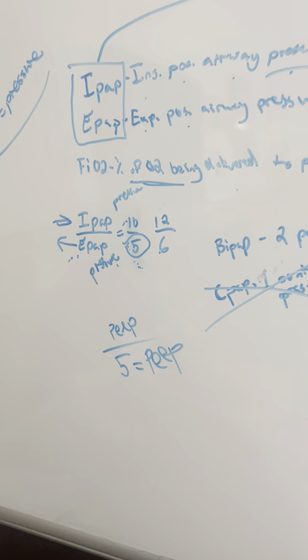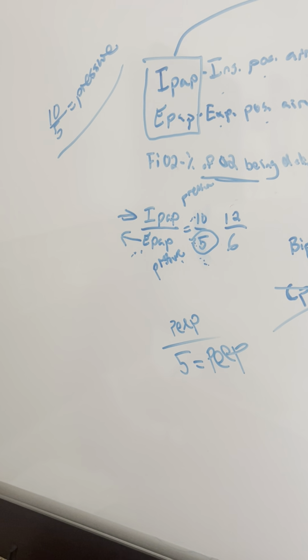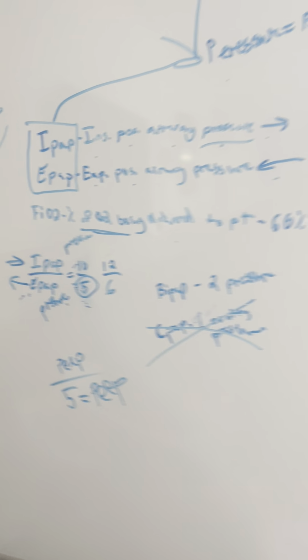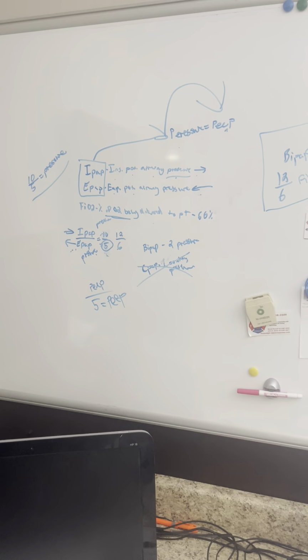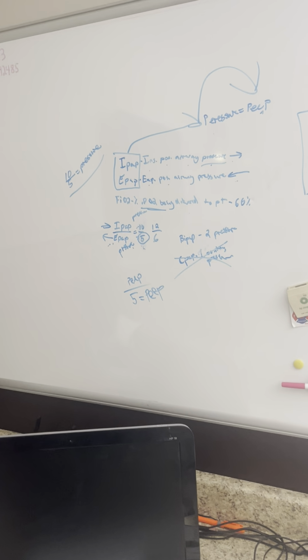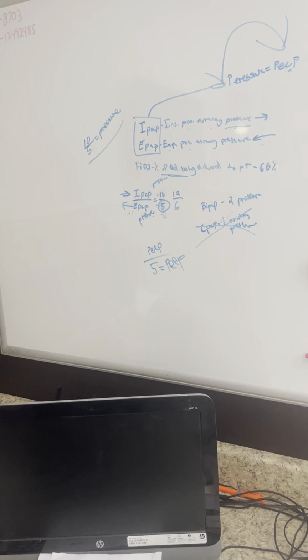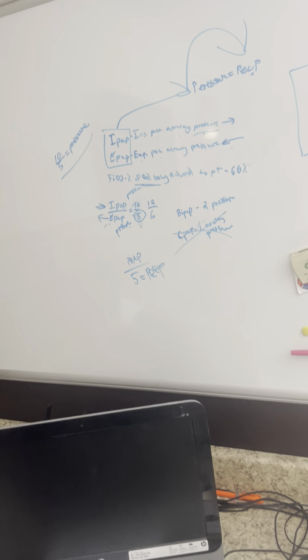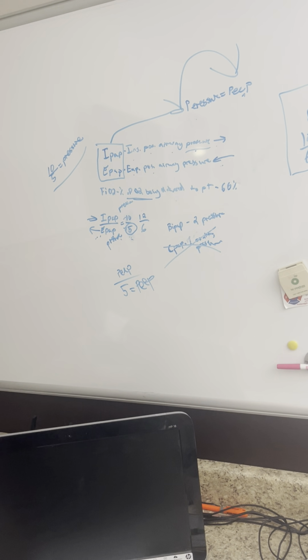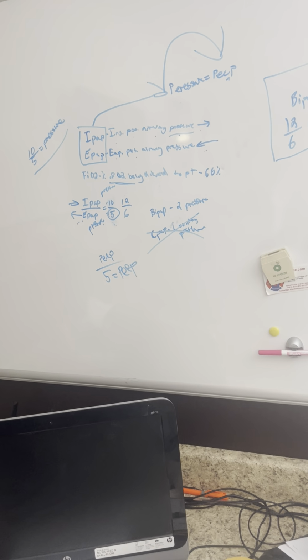Like I said, in the second video, I'm going to go over to the ambulance and show you how to get into all these settings on the vent, and some troubleshooting stuff to do, as well as some setting changes you can make and some common alarm settings. So yeah, if you have any questions on this, please feel free to contact me, and I will happily sit down and break it down with you in person.